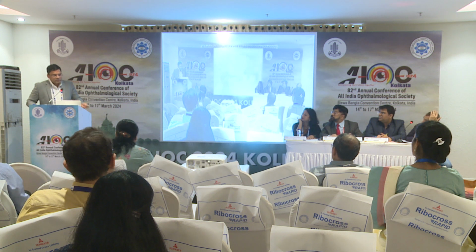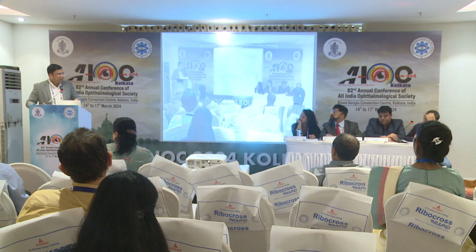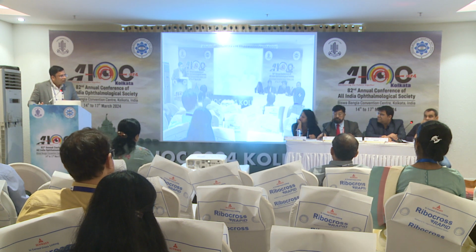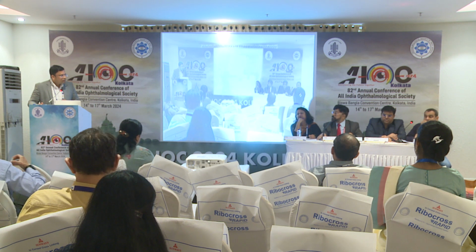Because the astigmatism was 4.5. Even if we had put an aniridia lens, there would again be an incision of 8 millimeters plus this 4.5, and in total we don't know how much he would have had. So we tried to reduce the astigmatism as much as possible, to 0.5. I don't know, but in SFL, having a toric lens is something.